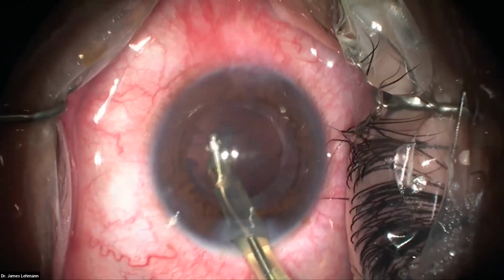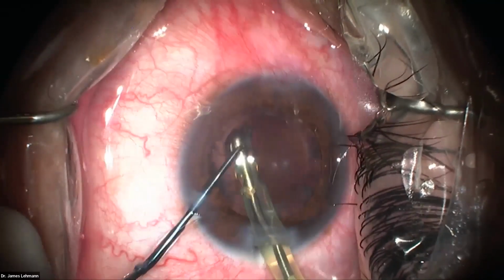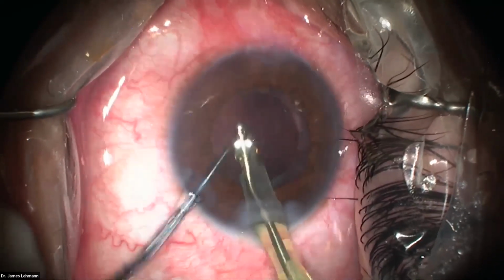Here's a little tip. If you're trying to get a little bit of nuclear fragment and you can't eat it with the INA, put your second instrument in and kind of smush it into the ostium of the INA, and you're able to eat it that way.